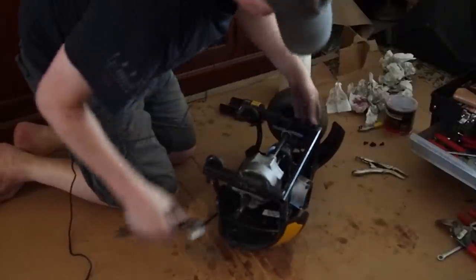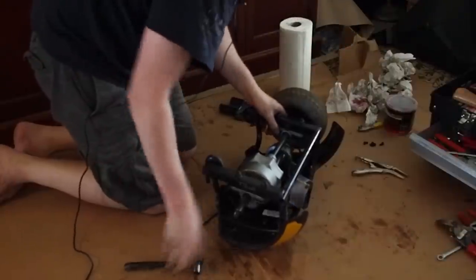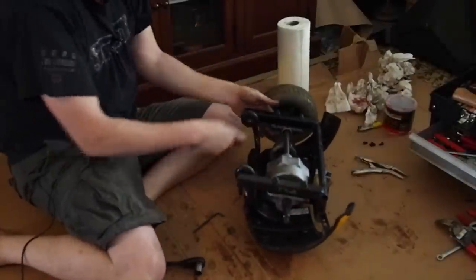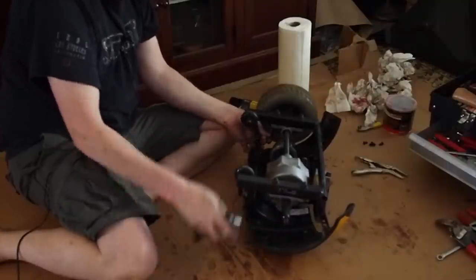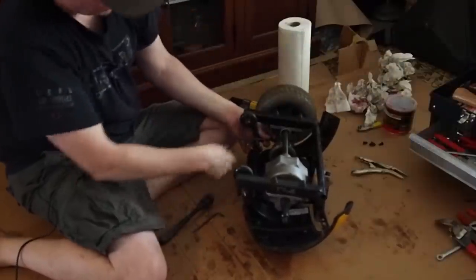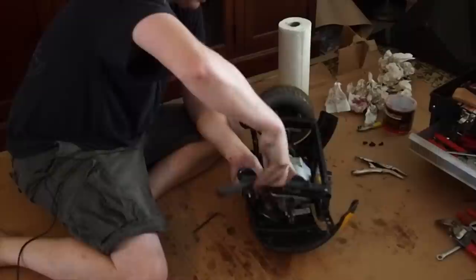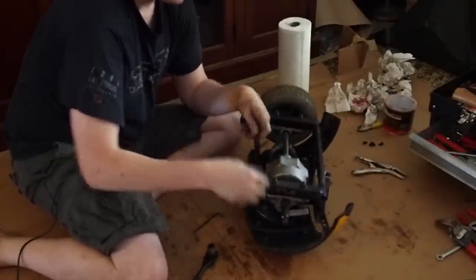So when you're putting anything on with these rubber washers, or any kind of rubber washers, you don't really want to crank it down too much. You want to leave some room. You want it to be tight, so it's taut, but you don't want it cranked down as hard as you can go, because you don't want to flatten out the rubber. You want to leave it somewhat intact so that it does absorb vibration. Otherwise, there's no point of even having the washer in there if you crank it down super tight.